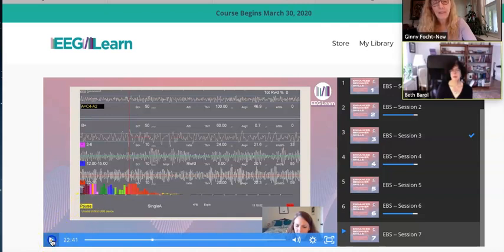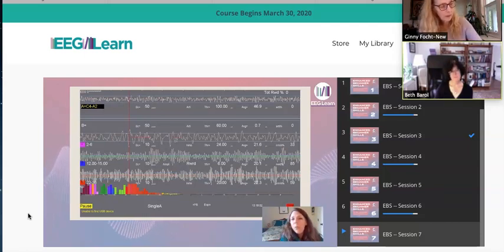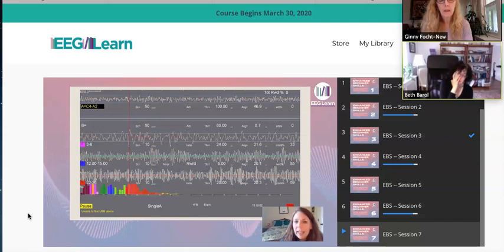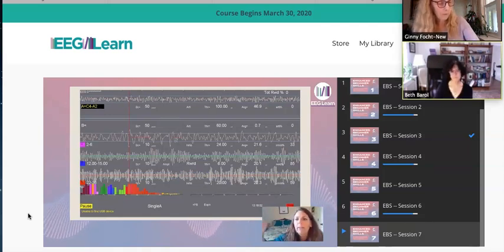Okay. With monopolar training, people get a better sense of what they're doing, because it's a more direct measurement. You probably already have had clients do this: they like to test out the mirror. So they'll tense up and see whether the yellow line or the red line goes up, or whether the yellow box gets big on Highway or Island.